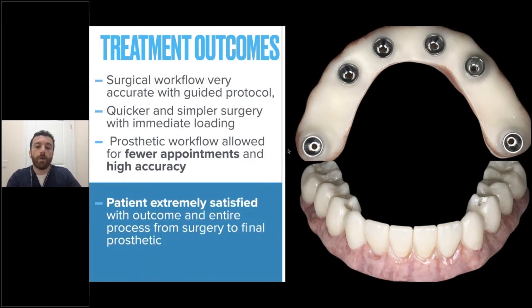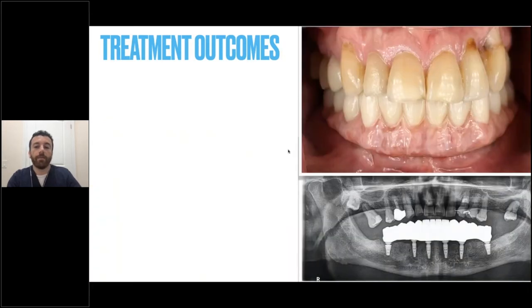So with this prosthetic workflow, we're allowing the patient to go through a minimum number of appointments with a very high degree of accuracy. And we're able to deliver results like this. So the prosthesis at the end looks very lifelike. We're not worrying about cleansability of the case because it's designed in a very tissue-friendly material.